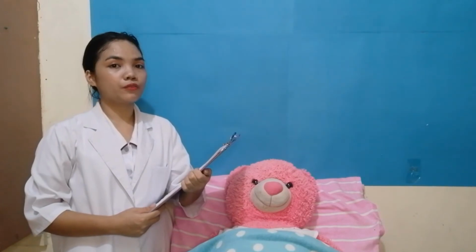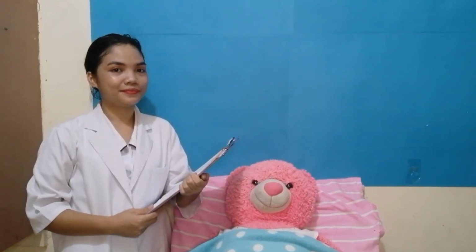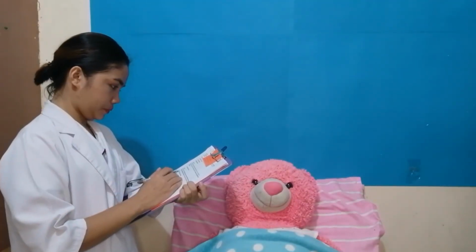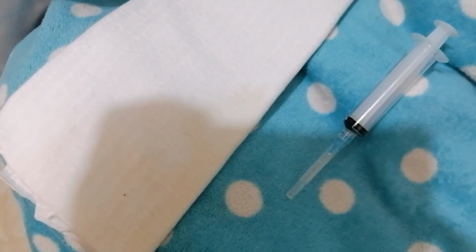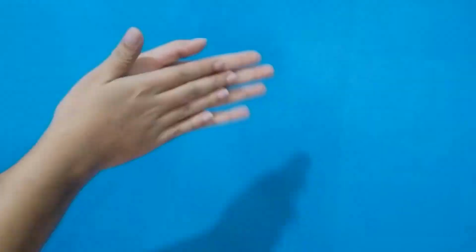Today, I am going to perform a removal of an indwelling catheter. The first procedure is to check the order on the client's chart. Next is to obtain a 5 to 10 ml syringe and an absorbent towel. Wash hands.